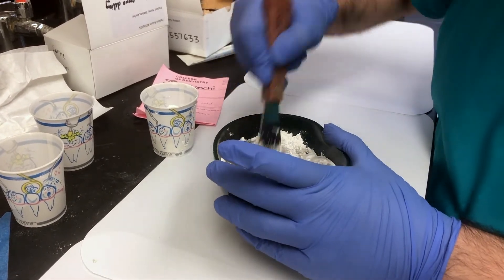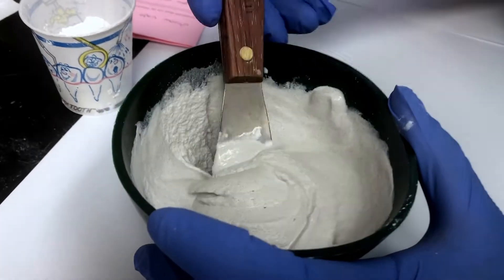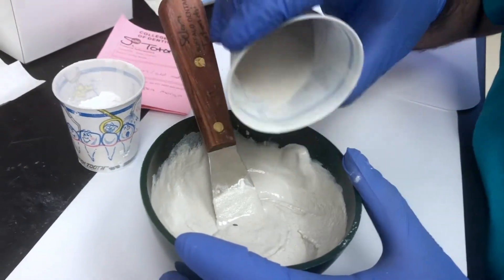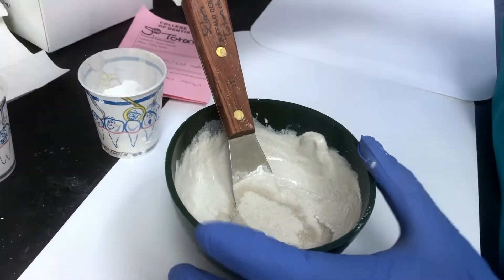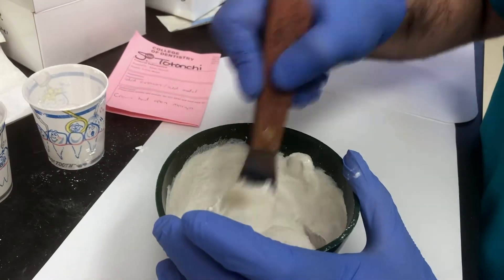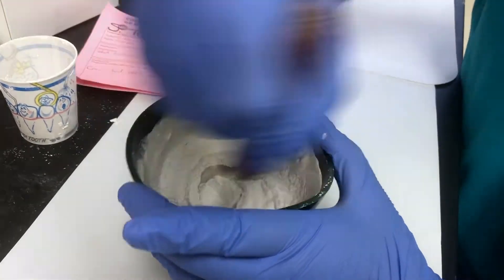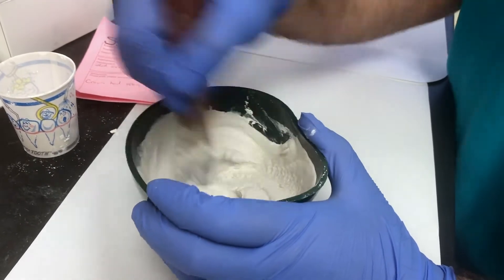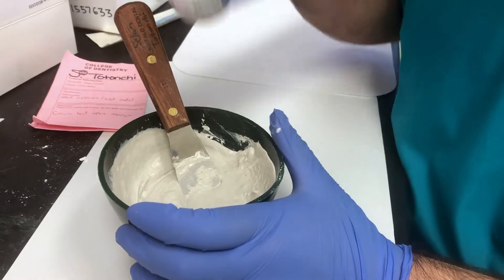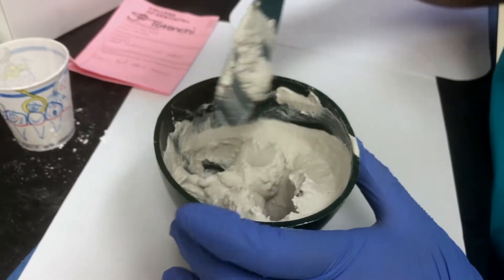Mix it until you get a nice homogeneous mixture that's not too wet and not too dry. This is too watery — it just plops right off. So I'm just going to add a little more pumice and a little bit of plaster. Okay, that's better. I'll keep doing that until I have the consistency I want. Now I have it the way I want — it's not too watery and not too solid.